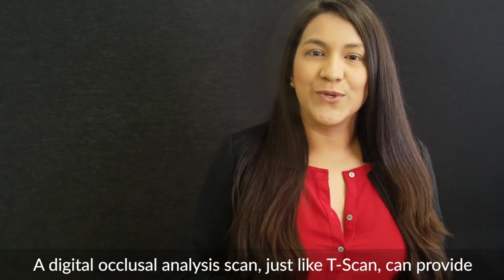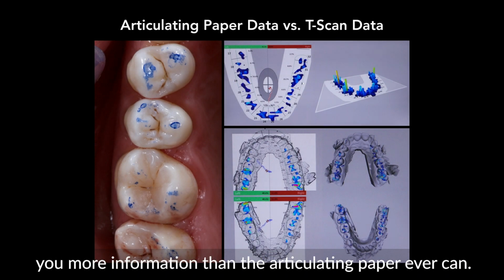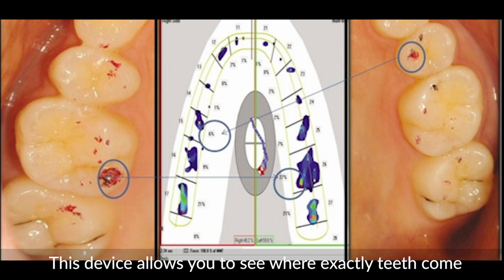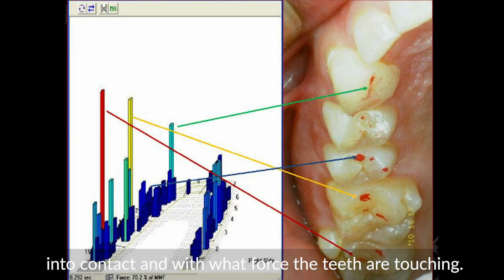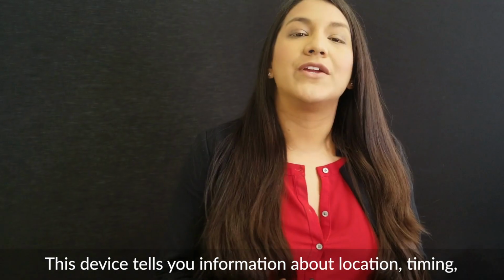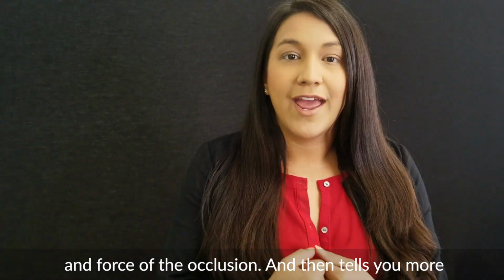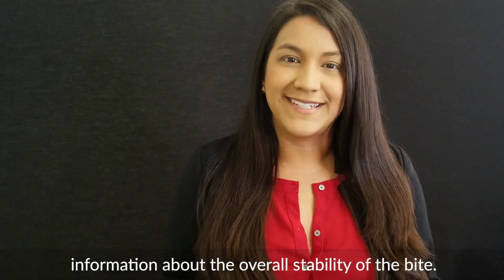A digital occlusal analysis scan, just like T-scan, can provide you more information than the articulating paper ever can. This device allows you to see where exactly teeth come into contact and with what force the teeth are touching. This device tells you information about location, timing, and force of the occlusion, and then tells you more information about the overall stability of the bite.